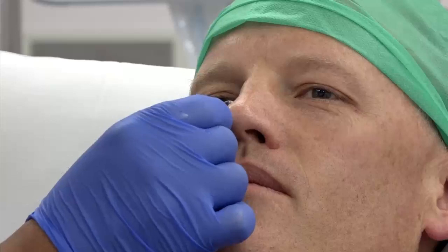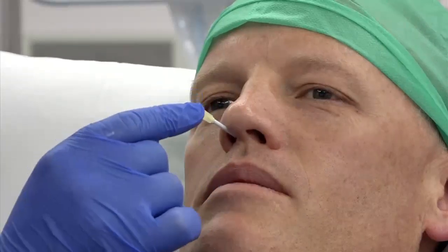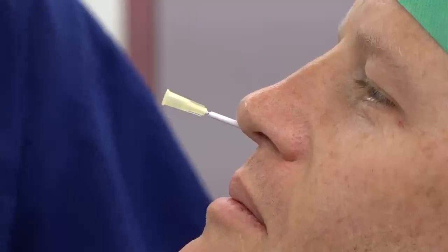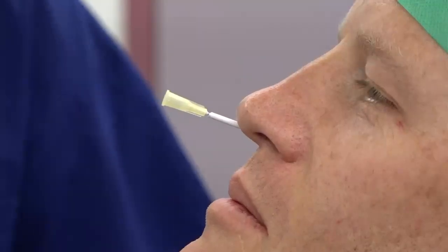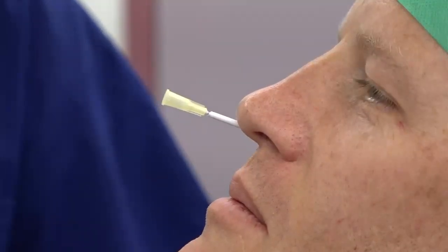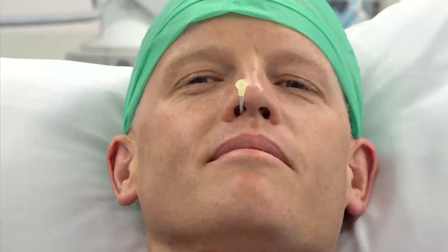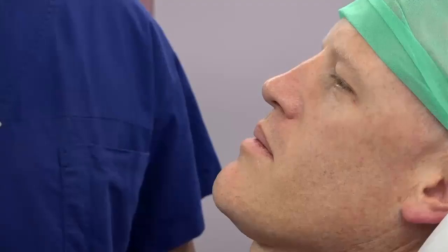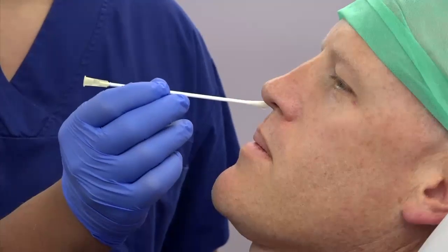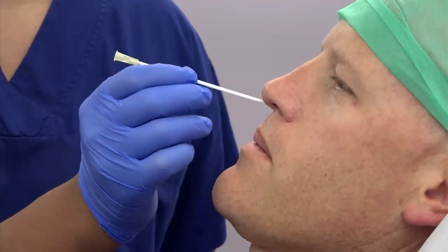Once you have encountered the posterior nasopharyngeal wall you will feel resistance. This is showing the same insertion again from a different angle.